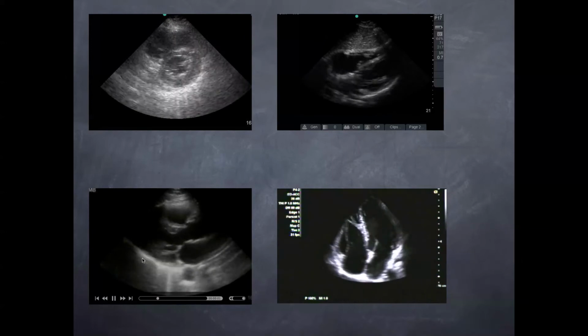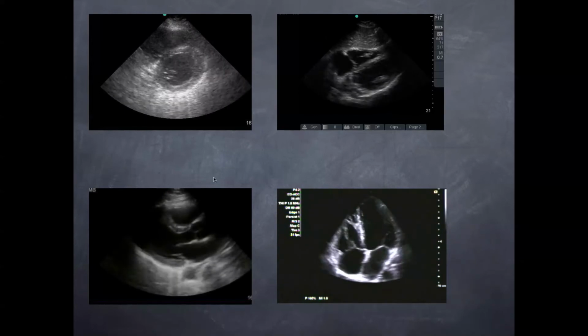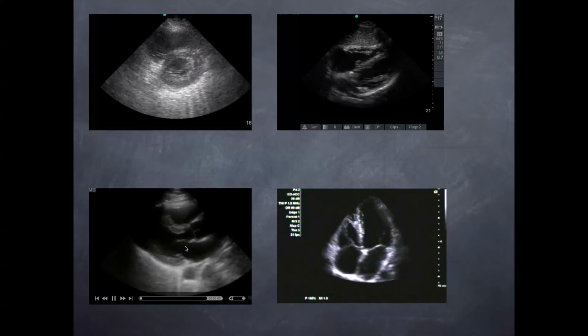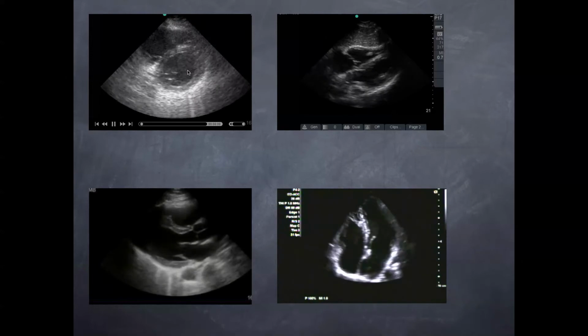You look at that to make sure that there's no fluid anterior to the descending aorta. Sometimes you can see a pleural effusion when it goes posteriorly. You also look at the ejection fraction. You can focus on that with the mitral valve and see, does the leaflet hit the wall. In addition to that, you look at the parasternal short to see, is it contracting together well.